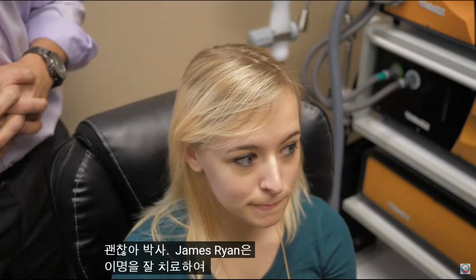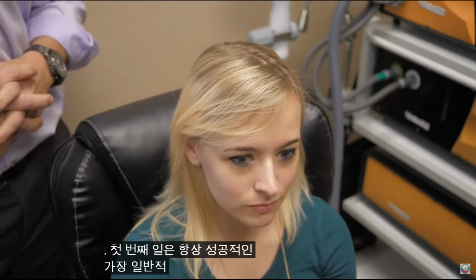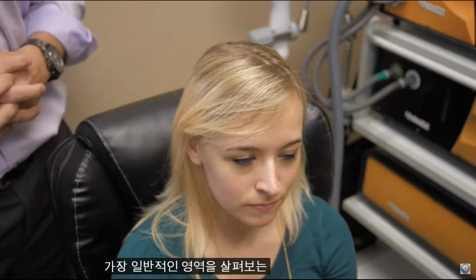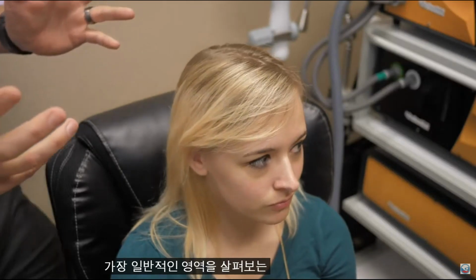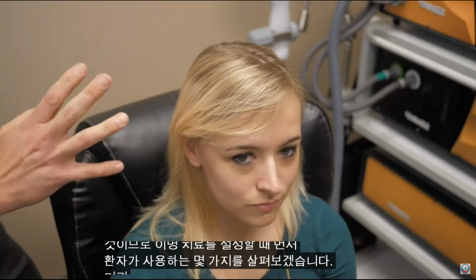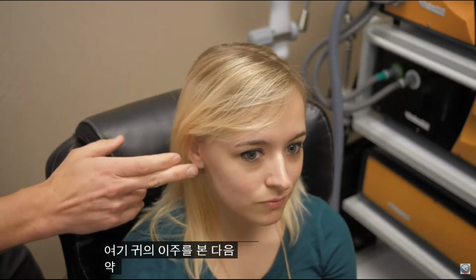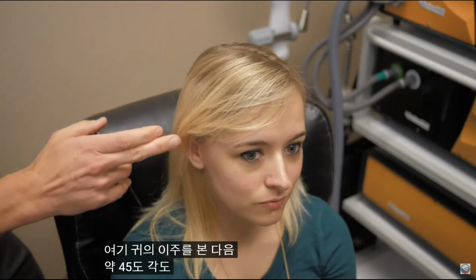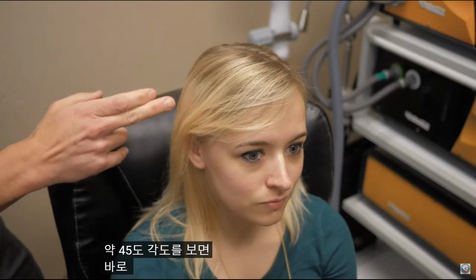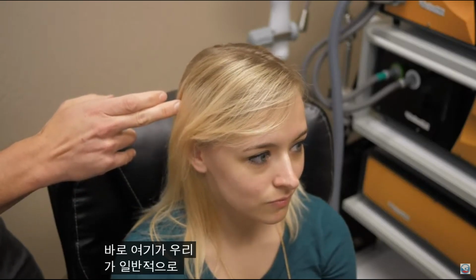All right, Dr. James Ryan, tell us how you would start off by treating tinnitus. Well, the first thing is we always look at the most common areas that are successful. So in setting up for the tinnitus treatment, we will first take a look at the patient, use some of the anatomy of the head. So if you look here at the tragus of the ear, and then you look at the angle at about a 45 degrees behind that, this right here is where we would treat typically for tinnitus.